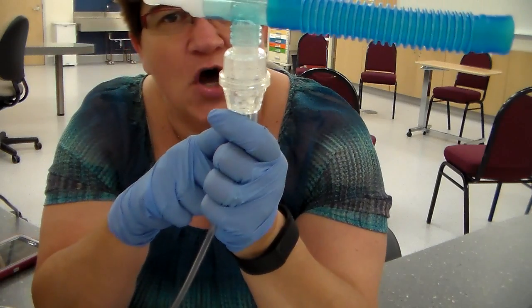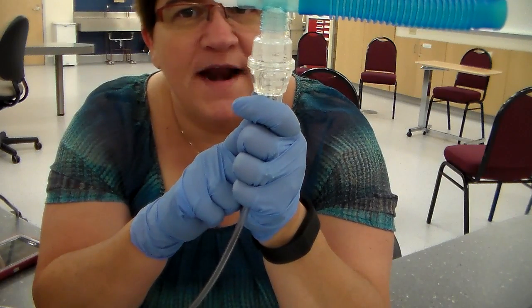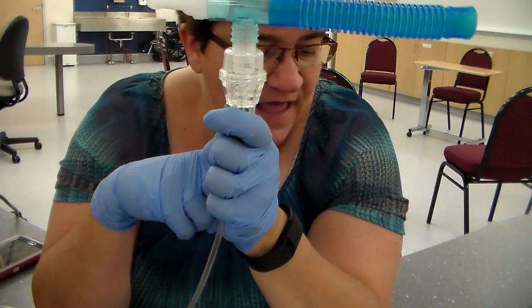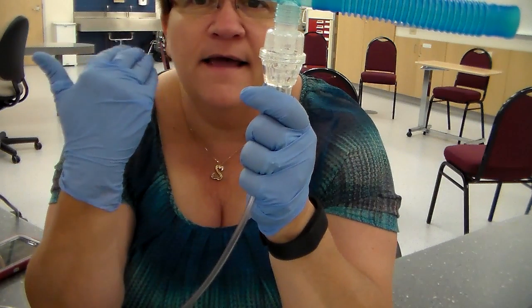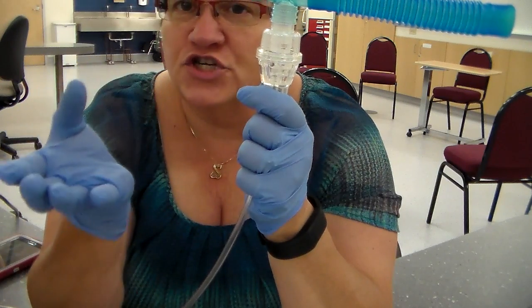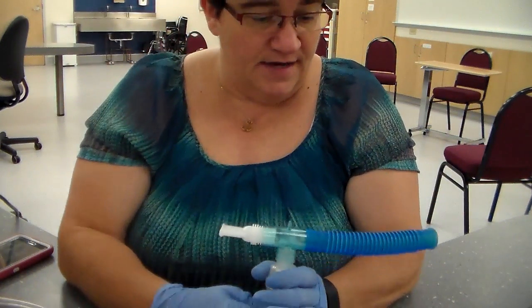Is this going to make them cough? You betcha. Okay, a breathing treatment normally will make them cough, and that's good because we want to open that up. We want to get those secretions out of there. Okay, all right. So then you're going to turn the airflow off, and you're going to adjust or put back in the nasal cannula, or if they're needing oxygen, you're going to make sure that you have the correct flow of oxygen, okay?